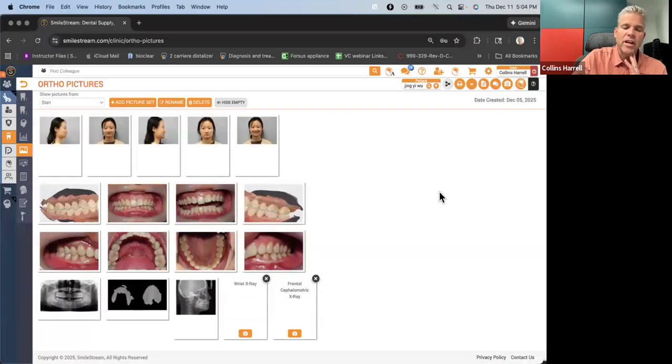And then you can tell her from there, when you go over to the aligners, you're going to be working on moving the teeth slowly back in the upper. So it's going to be a little bit longer treatment. It should work well for her because of her strong muscles. The distalization plans work better for those patients.